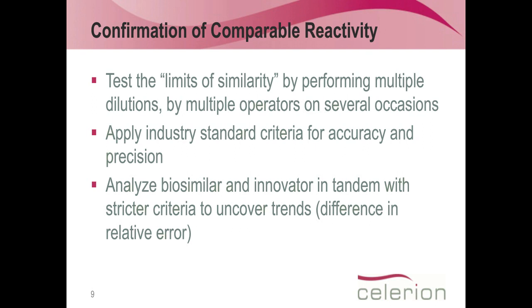Most people want to keep everything nice and tidy. We also keep it nice and tidy, but we intentionally introduce a variation by changing up incubation times, incubation temperatures and things like that. We want to really stress the assay now and basically show that despite treating it so badly, we will still achieve all acceptance criteria which are demanded by the authorities.